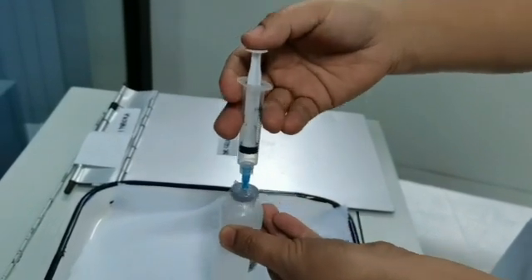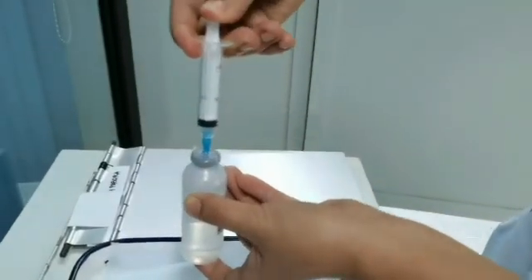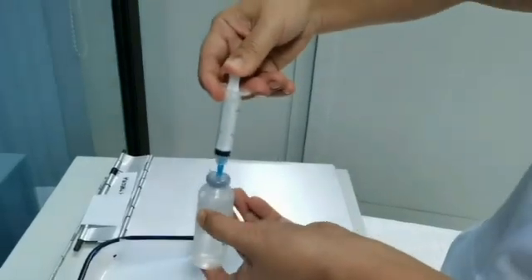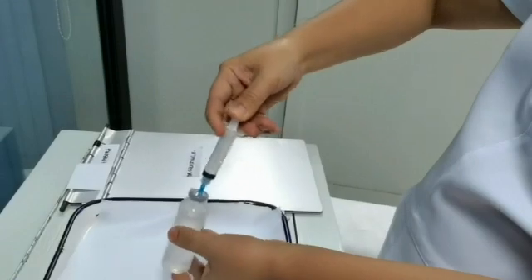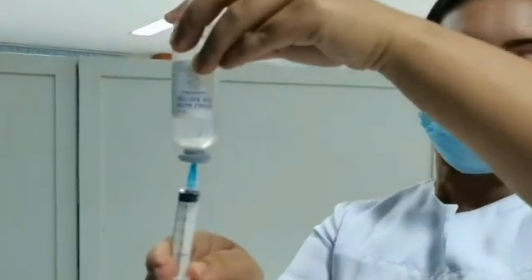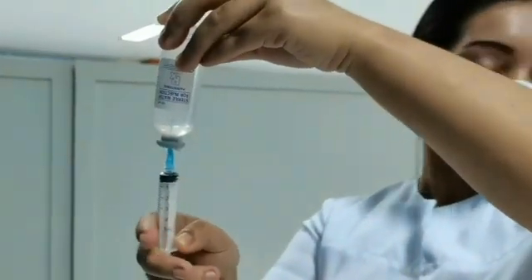Press end of plunger down to instill air into vial. And hold vial with non-dominant hand and turn it up, keeping needle or spike inserted. Control syringe with dominant hand and keep plunger down with thumb.